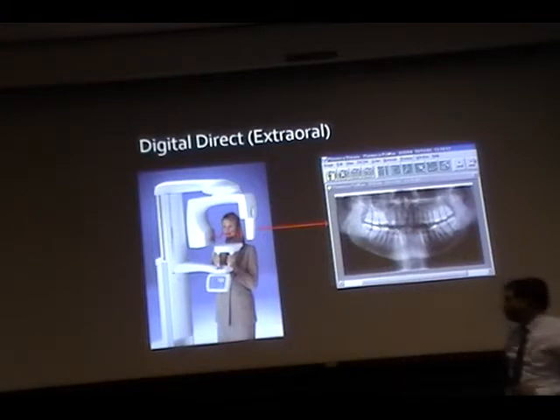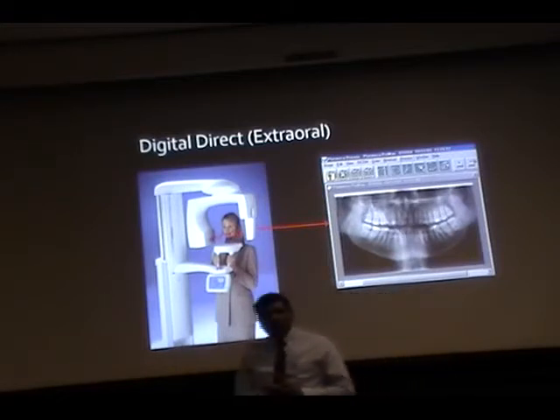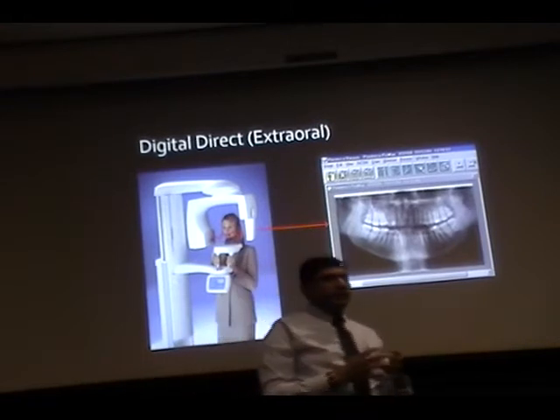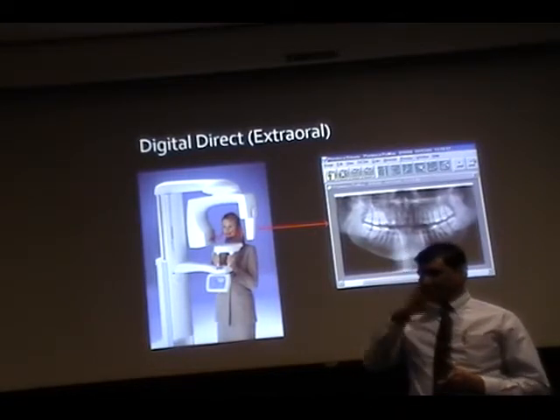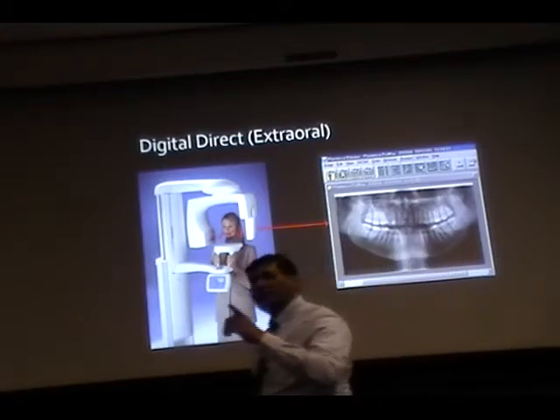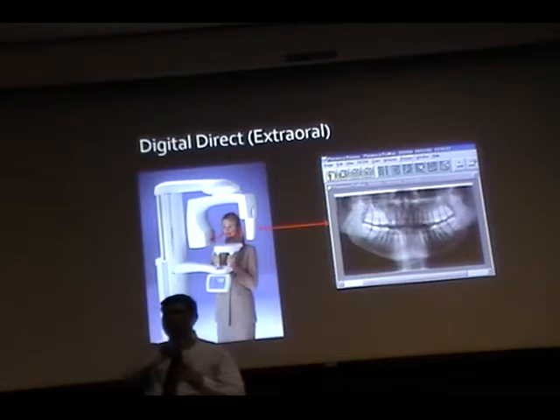Now, what is the downside of using the flat panel versus the image intensifier? Flat panels incorporate more pixels. So what does that tell you? If you are using more pixels, you get a clear image. What is the downside of that? If you are getting a clear image, more processing time. Okay, but prior to that, I want one more step before that. Longer to do it.